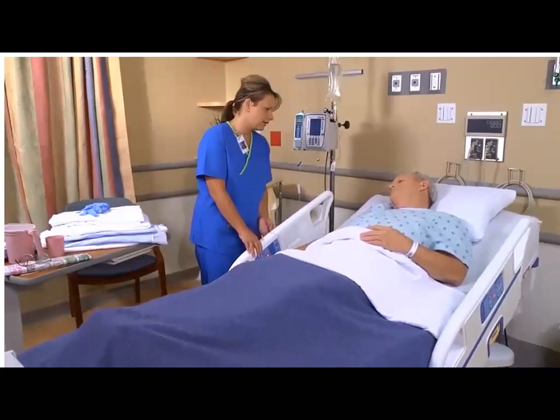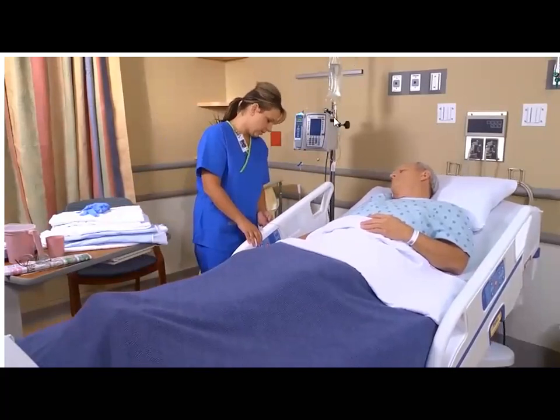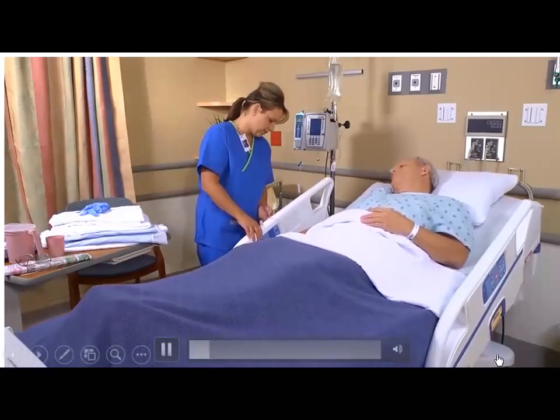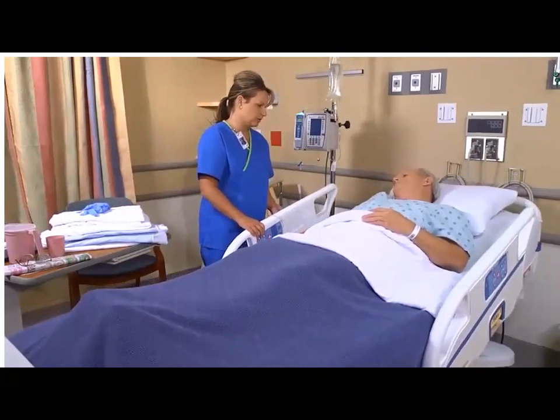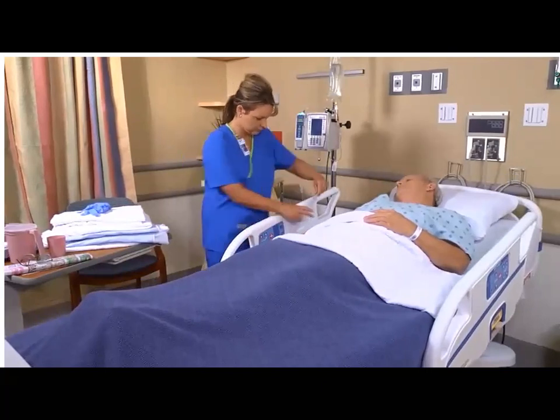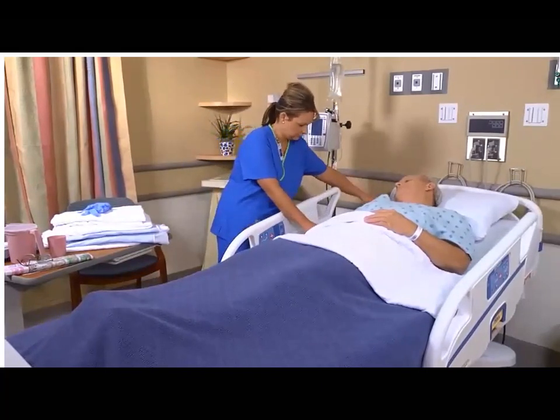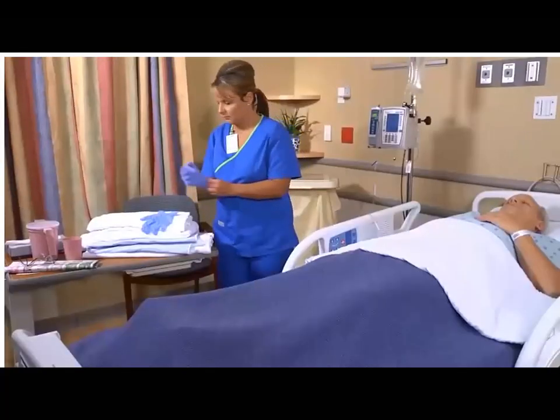Do you do okay lying flat? I like my head up a little bit. Okay. Raise the bed to a comfortable working height and lower the head of the bed as much as the patient can comfortably tolerate. Is that good right there? Yeah, that's fine. Okay. If he's on aspiration precautions, keep the head of the bed no lower than a 30-degree angle. Put on clean gloves.